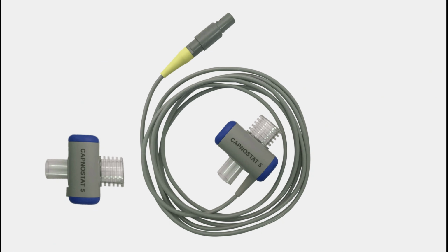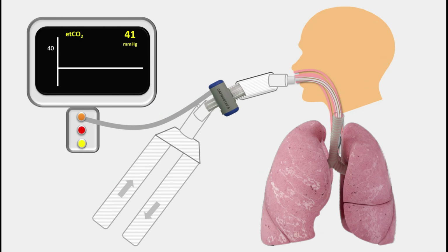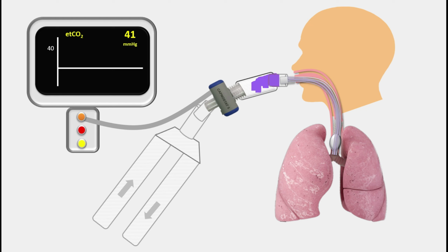This is an example of an ICU end tidal CO2 sampling device developed for Philips monitors. In this situation, the device is located within the breathing system and it's connected directly to the monitor by a wire, so it's a mainstream device. There is no water trap. A similar waveform and number are recorded. Most importantly, when you use mainstream devices, there is no delay with CO2 measurement.